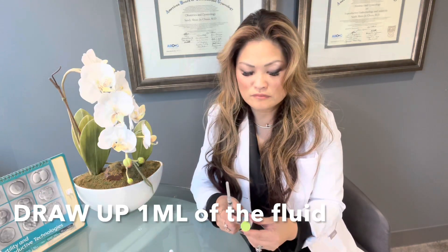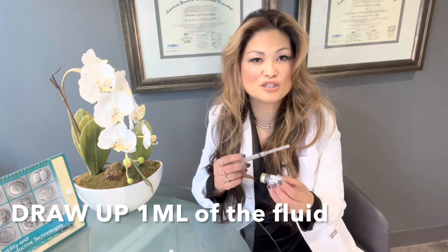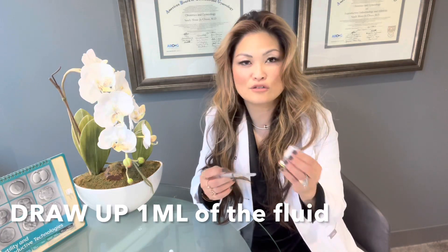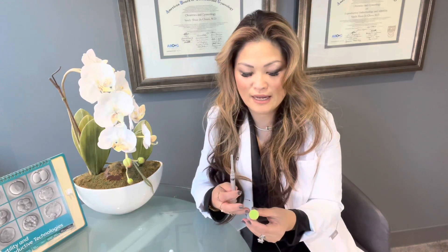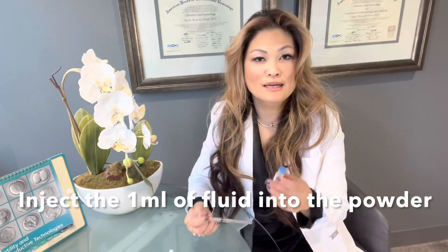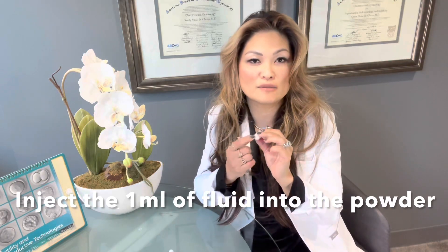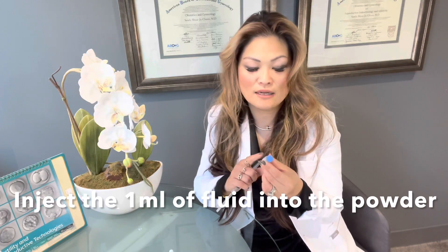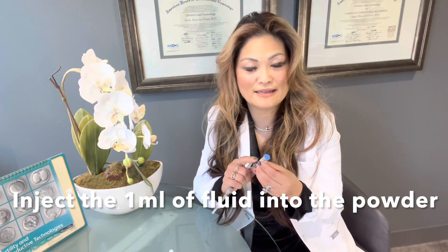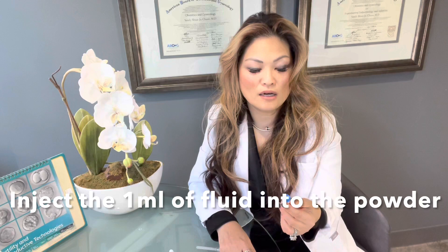That's what you will need to mix your growth hormone. If you do get some air bubbles, you can always push the air back in and then draw it over again — it's not a big deal. But try to make sure that you're getting just one ml of fluid. Once you get that one ml of fluid, pop open the bottle with the powder, clean the top, and then go ahead and put all of the fluid in. Gently swirl it so that the powder can mix, and make sure all of the powder dissolves. It should be pretty easy — most of the time it dissolves very easily. Do not shake it vigorously because that will create a lot of air bubbles, and we want to try to avoid that.